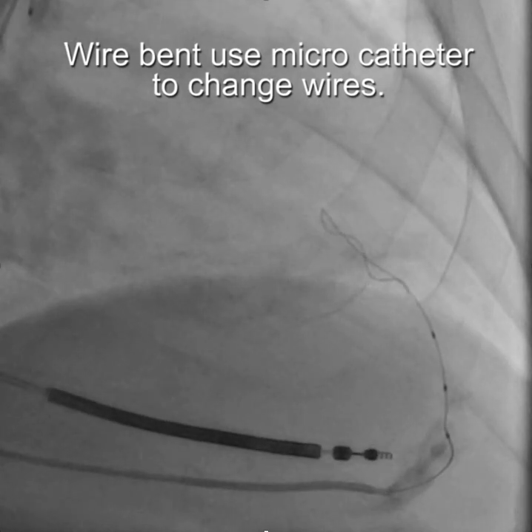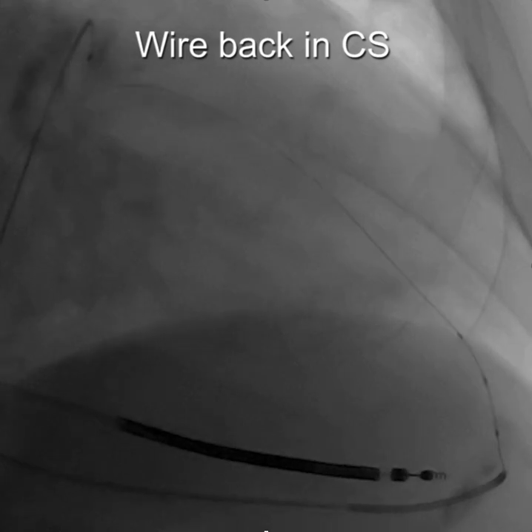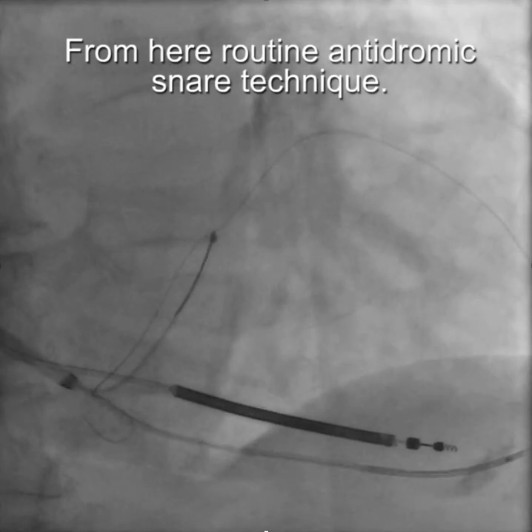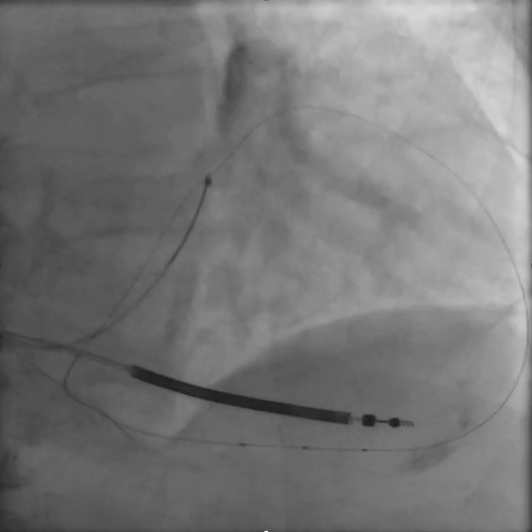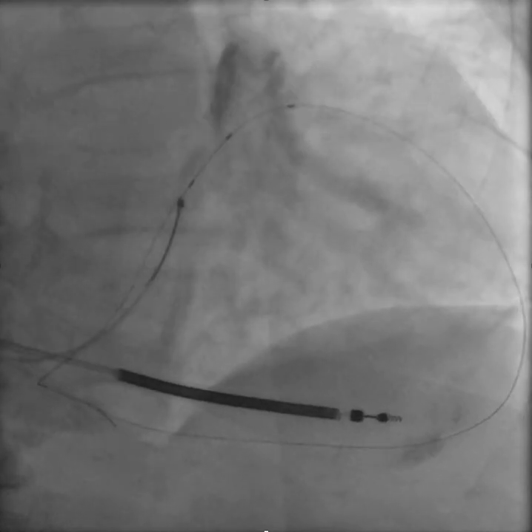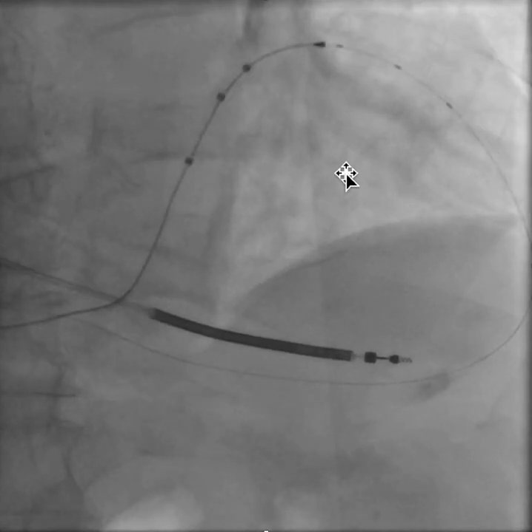What we can do is remove the wire — the bent wire — and put in a fresh wire that goes back into the coronary sinus. From there, it's a routine process where we snare the wire and then replace the vein selector with a microcatheter. Then we're advancing the wire into the target vein.